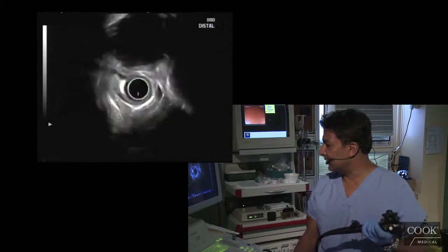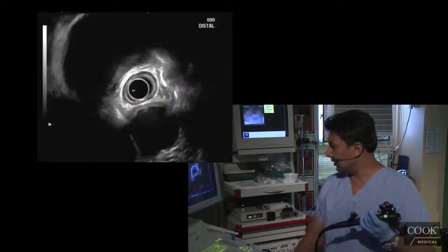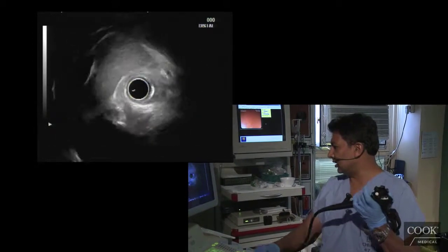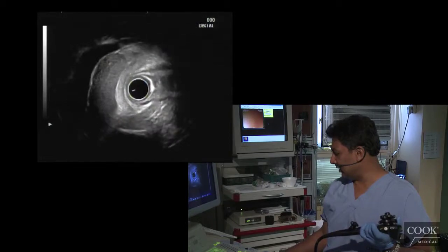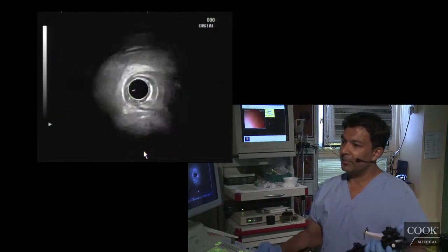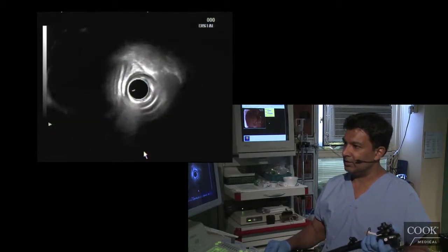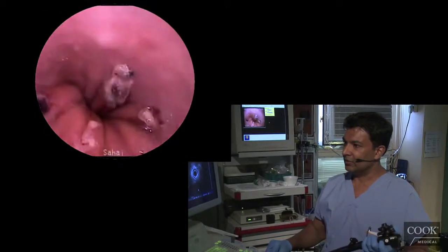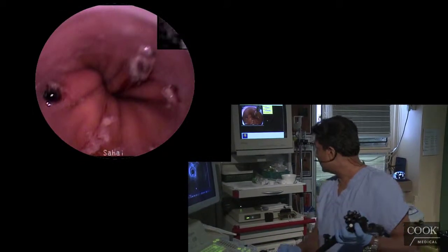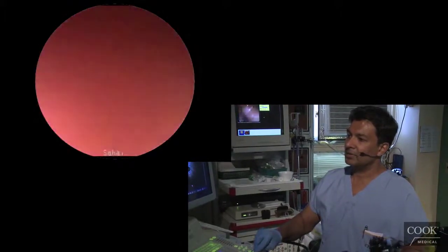With the radial, we just go straight down, keep the aorta at six, push in, get through the GE junction — you see the aorta down here — pushing in, hitting a bit of a bump here, so I'm going to go over that. And look at that, he's got some pretty good esophagitis there. He might even have a bit of a Schatzky ring or something, because there's a little bit of resistance here.